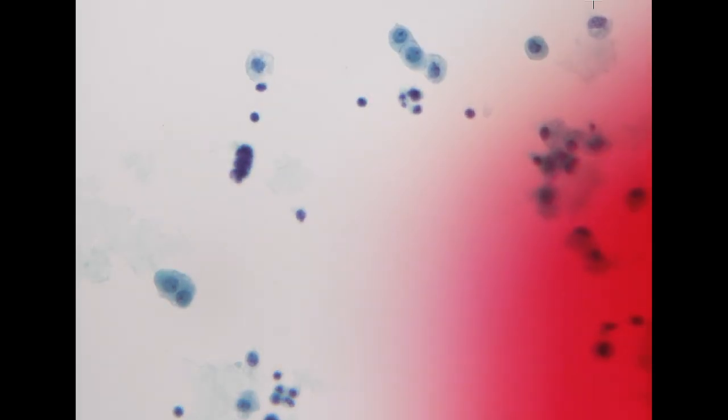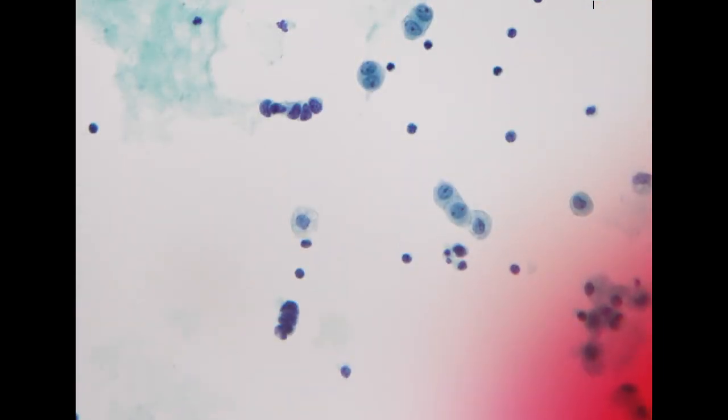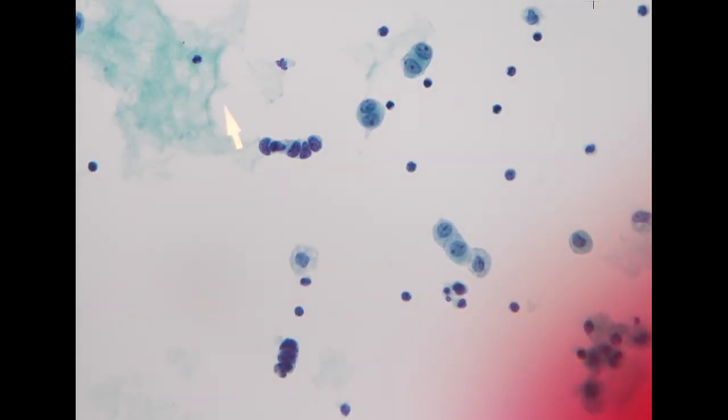Yeah, because sometimes the screener can miss it. So as a sign-out doctor, you really need to catch it. Because it is so tiny, it is kind of difficult to catch, because it looks like inflammatory cells under a low power view. But when you get to higher power view, this is the size of the normal lymphocytes.